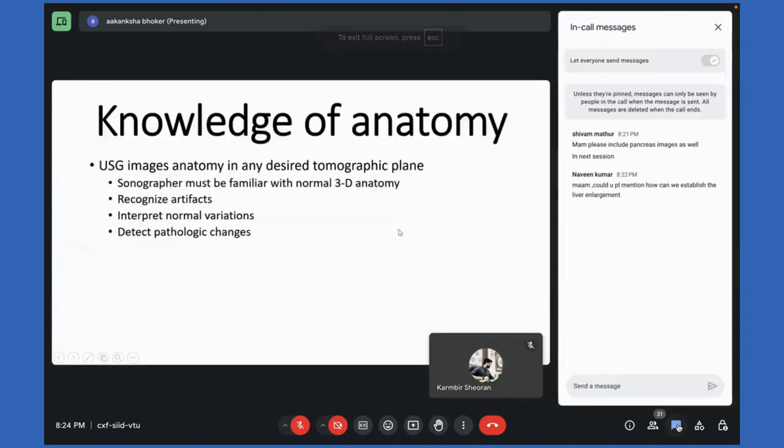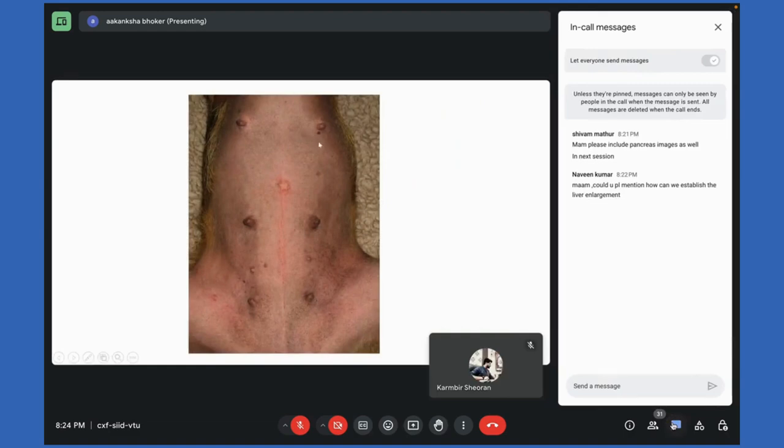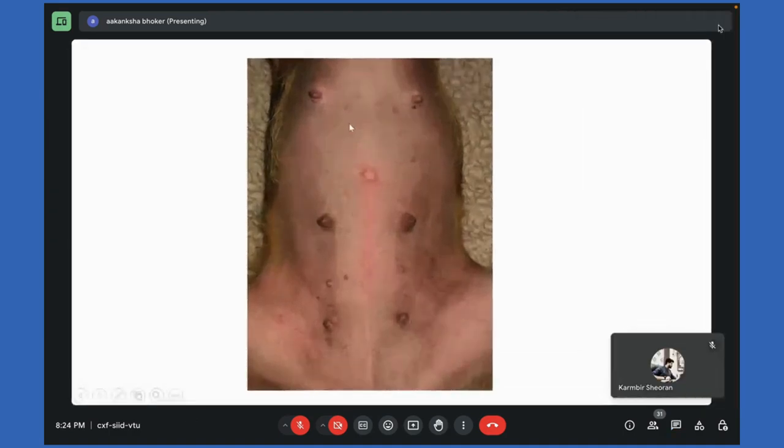But now see here. Suppose we want to scan the stomach. Somewhere on the left there will be the cardia, then the fundus, the body will be till this area, and on the right side there will be the pylorus. So the stomach lies a little bit transversely within the body. For obtaining the longitudinal view, the transducer is placed here, straight. But if we want to scan the longitudinal axis of the stomach, then the transducer will be placed like this. It will be a transverse view of the animal, but a longitudinal axis of the stomach. Is it clear? Okay, ma'am. Thank you.